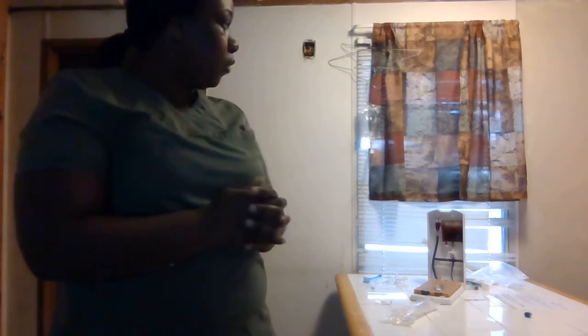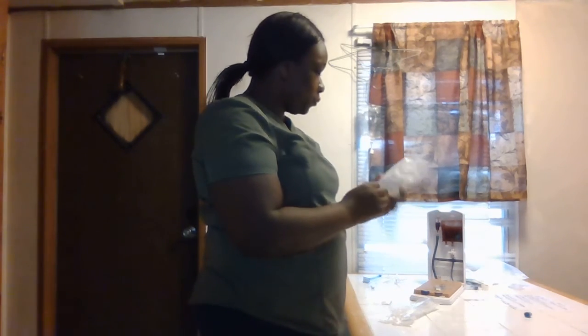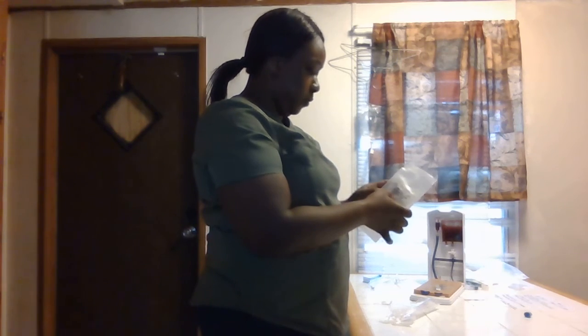Okay, so that's programming the pump, and then I can go ahead and do my secondary bag, which is my antibiotic, my Kefsol 75 milligrams. It's a 50 milliliter bag. And I'm sorry, this was a 500 bag.